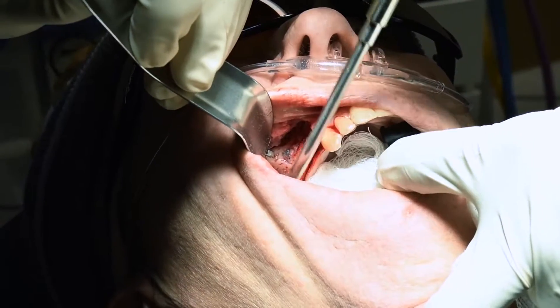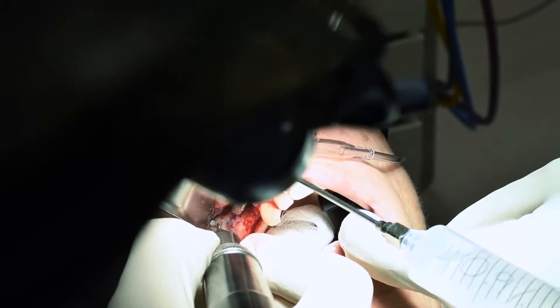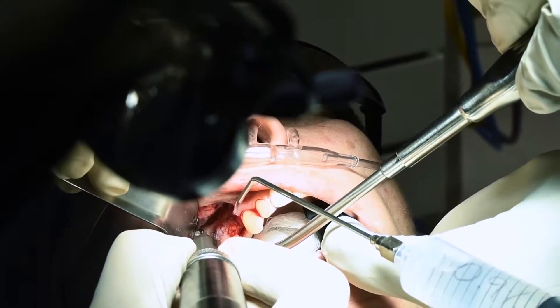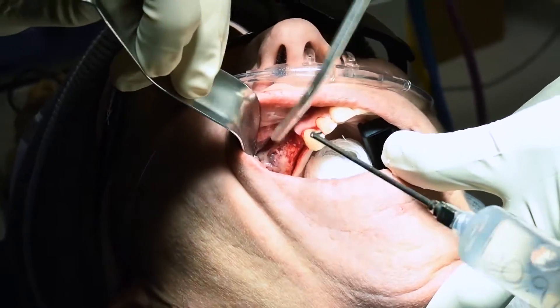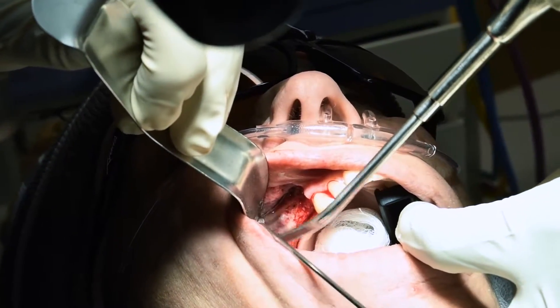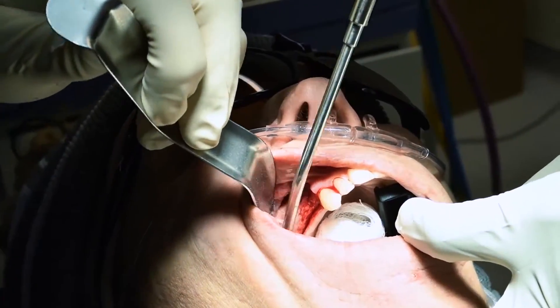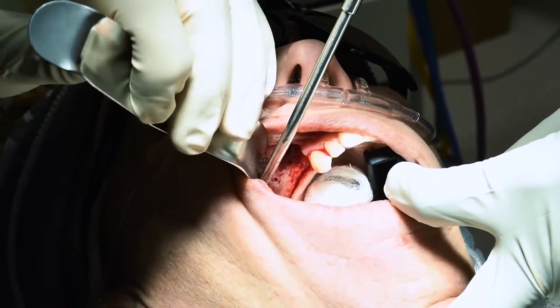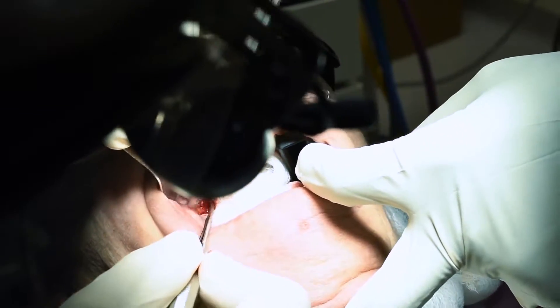Now we're going to make sure that that's smooth — I don't want that to be rough and bothering her in any way. We'll have some irrigation. This soft tissue right here needs to go — it has some little metal fragments in it, let's get rid of that. Now it's all nicely cleaned up.